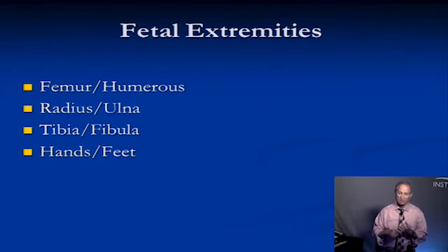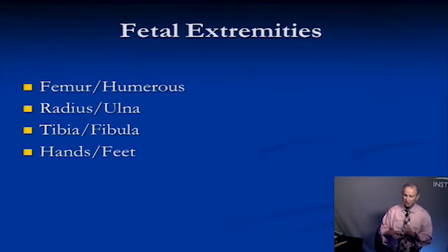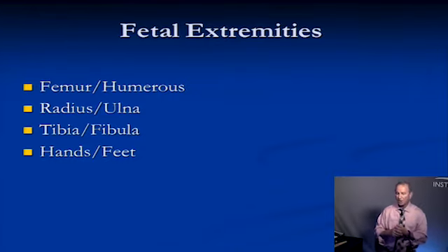Well, I might have a baby with Down syndrome. Maybe the dates are not correct. Or I might have some other skeletal abnormalities. If the dates are not correct, your head and abdomen measurements will match the femur. But if they match 18 weeks and the femur is 14 or 15 weeks, then more likely I have a baby with Down syndrome or a skeletal abnormality.